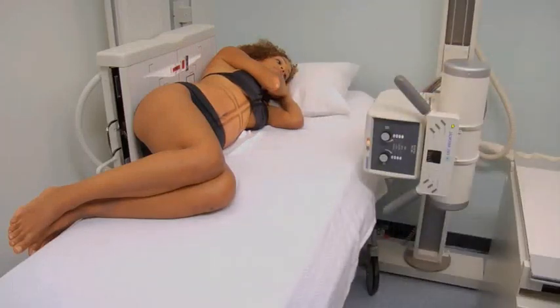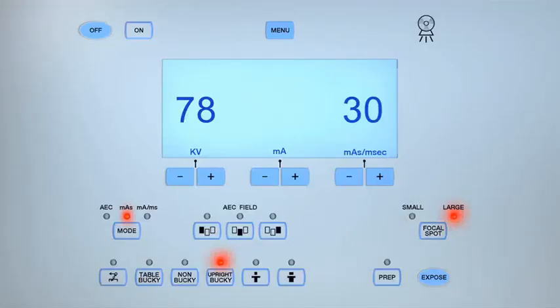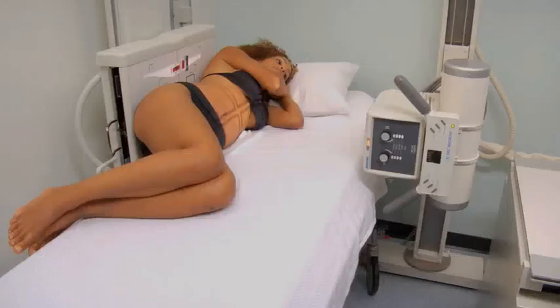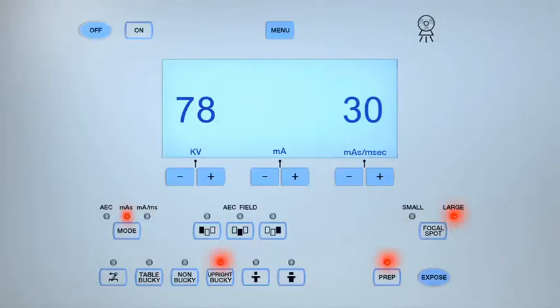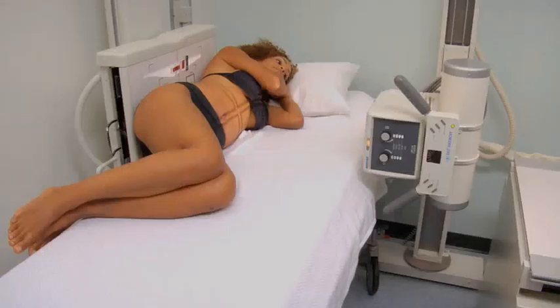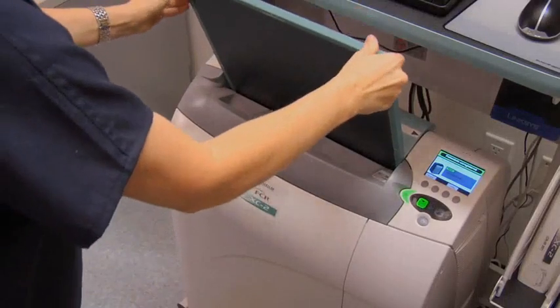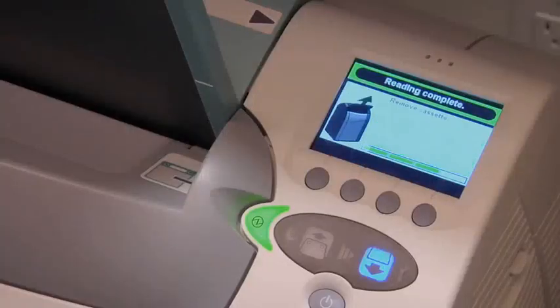Move behind the protective lead barrier. Check that the exposure technique is appropriate for the patient's body habitus. Ask the patient to breathe in, then out, and then to stop breathing. Expose the cassette when ready, and then tell the patient that they may relax and breathe normally. Remove and process the cassette.